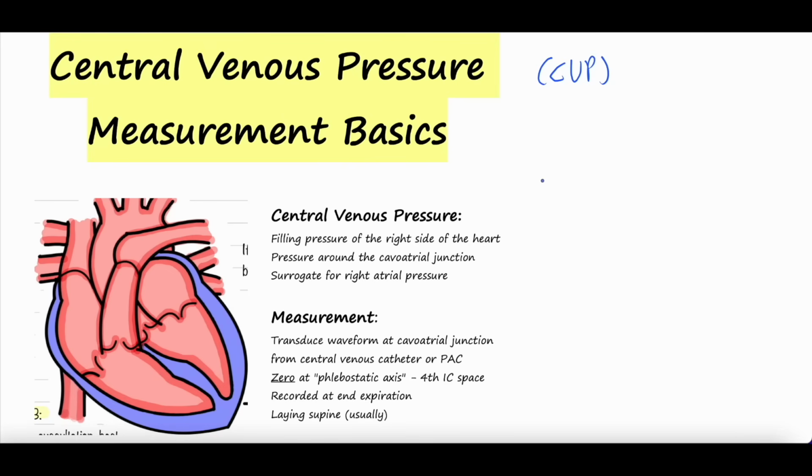The phlebostatic axis, zeroing, what normal values are, what they mean, etc., etc.